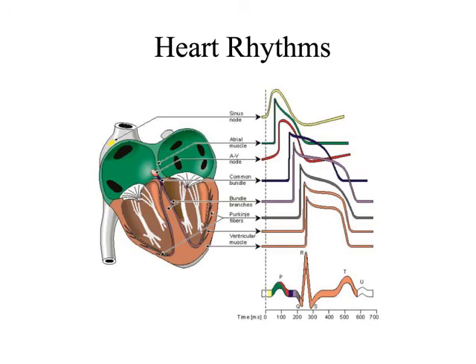So here again, we see that this is just graphed out, nice and neat, where we see the different areas and how they're firing, when they're firing, and that QRS complex is the thing that we're watching out for, right? That's going to be when there's the most motion in the heart. That's when we don't really want to be scanning.